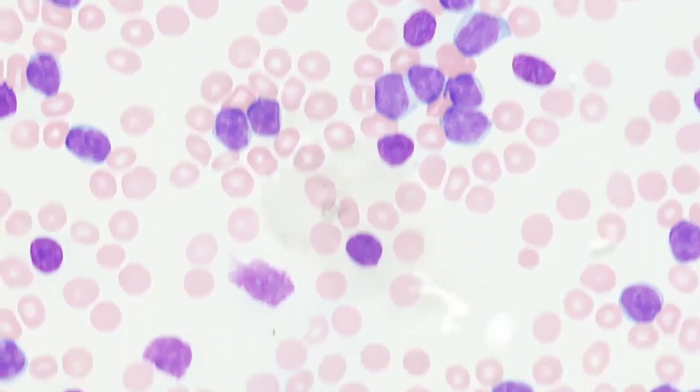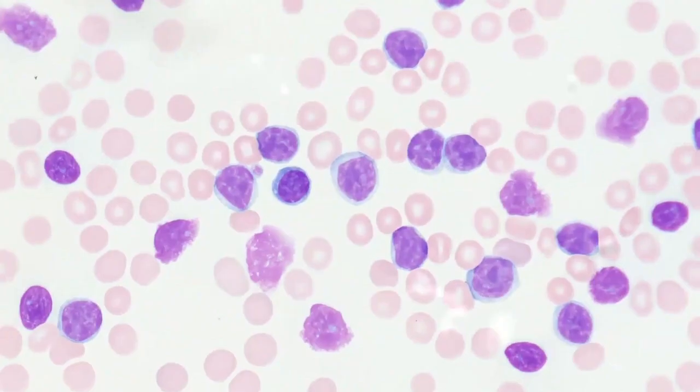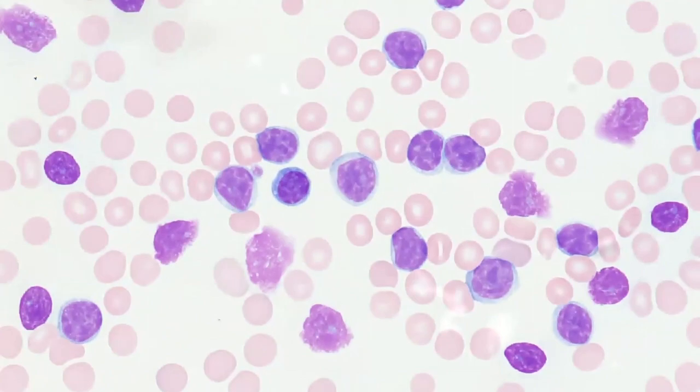Additionally, as we scan around, I want you to take note of the highly condensed chromatin pattern seen in these leukemic cells. This chromatin pattern is relatively unique to chronic lymphocytic leukemia, or CLL, and is characterized by this densely packed nuclear chromatin. The peripheral blood findings characteristic of CLL include elevated white cell count, a variable number of smudge cells, and the absolute lymphocyte count is usually greater than 5 times 10 to the 9th per liter.